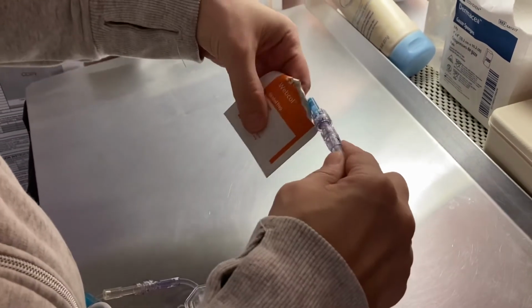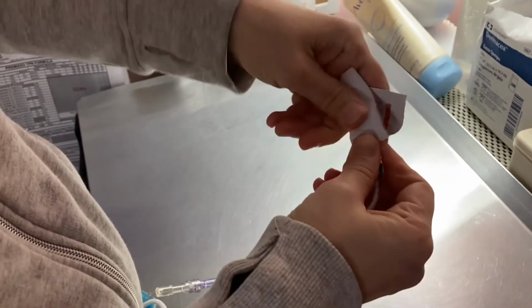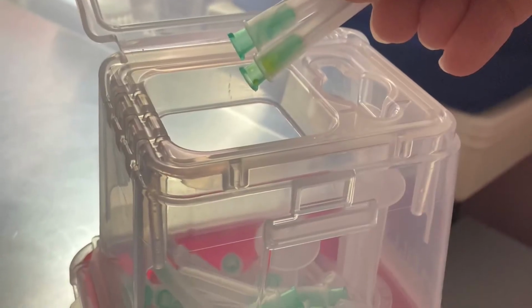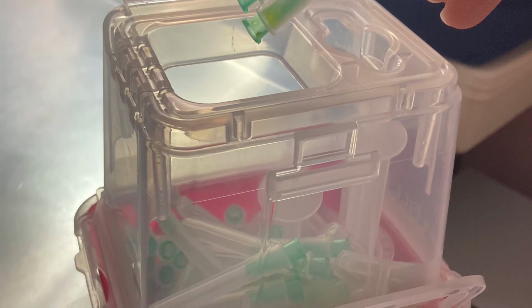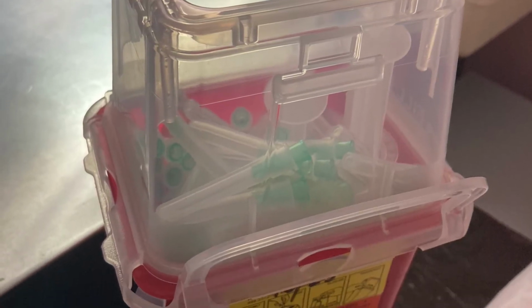Make sure that blue cap is tightened, and I always put extra protection and wrap it in this alcohol pad. The sharps container is on the first shelf in her cupboard on the right hand side. I just throw the needles in there, and the syringes and recycle.